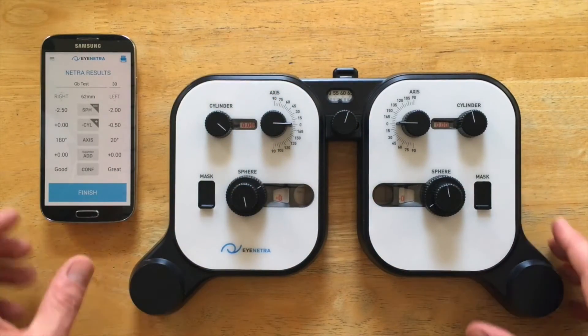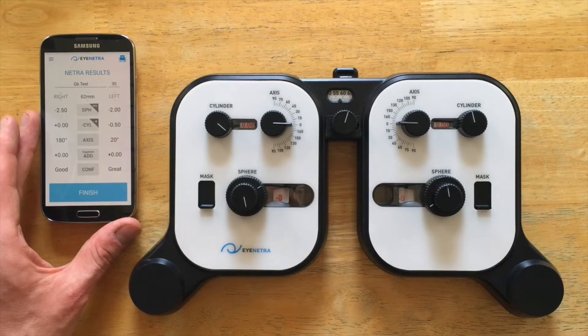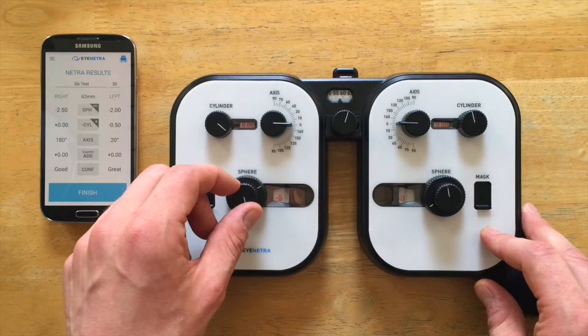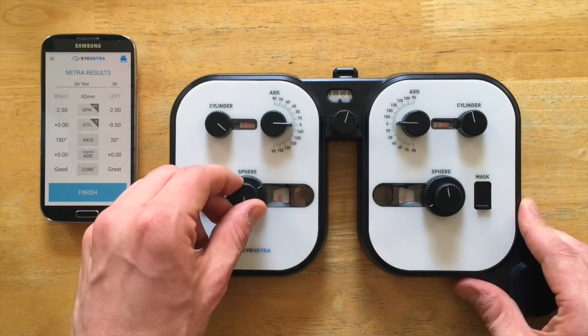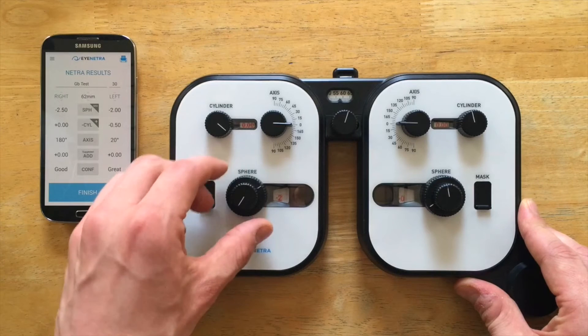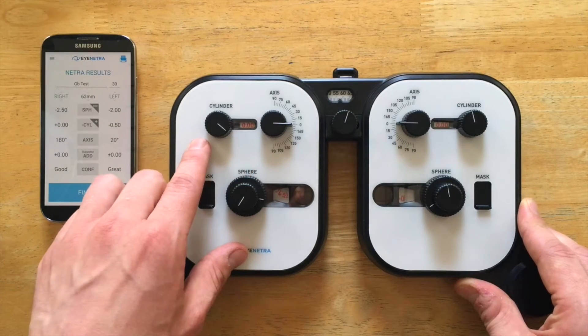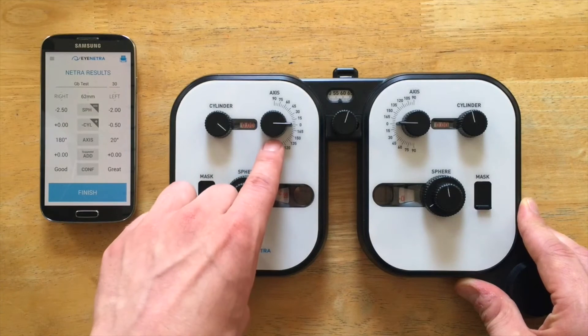So let's take a look at these results right here. I just ran myself through a Netra refraction and I'm going to dial them right into the foreopter. Starting with the right side, I'll go minus 250 — click down 1, 2 and then 1, 2 for 250. I have no cylinder there and so I'll leave my axis right at zero.